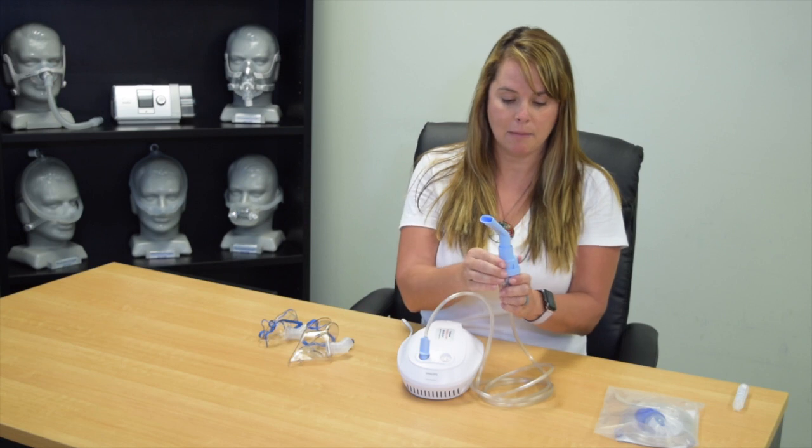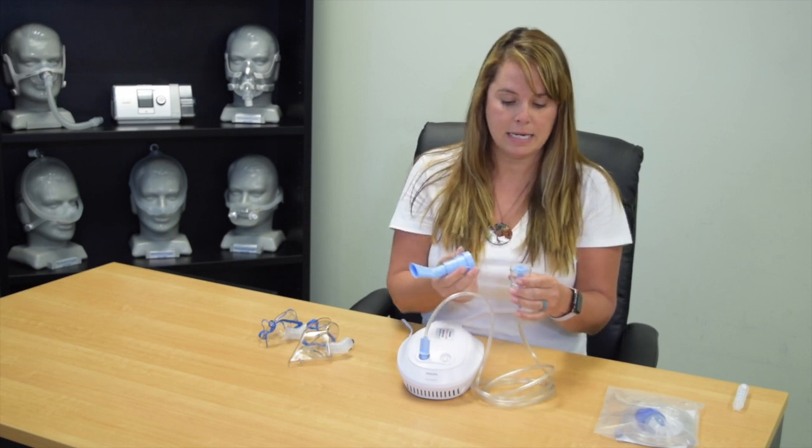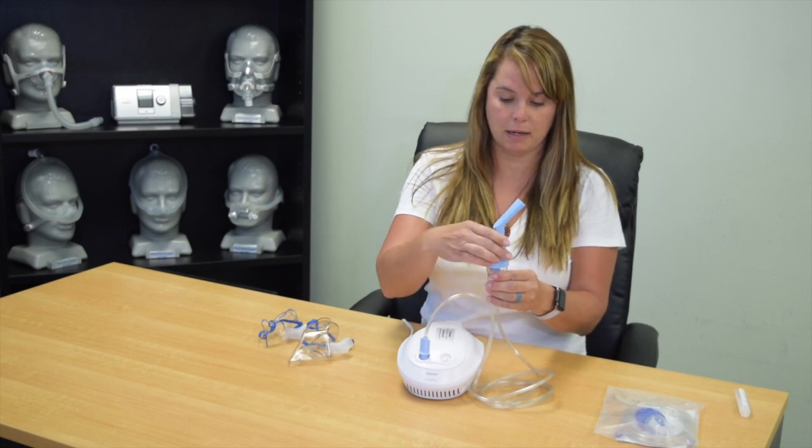So I'm going to go ahead and put my mouthpiece back on here because that's what I'm going to use today for the demo. I'm going to unscrew my lid. Now the medication is going to be prescribed by your provider and will be picked up from your pharmacy. So today I'm going to put my medication into my nebulizer cup. And I'm going to go ahead and screw my lid back on.